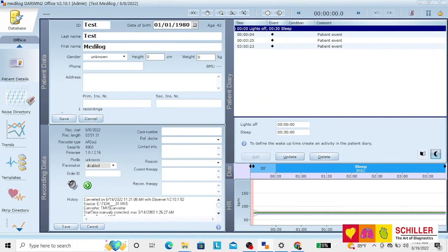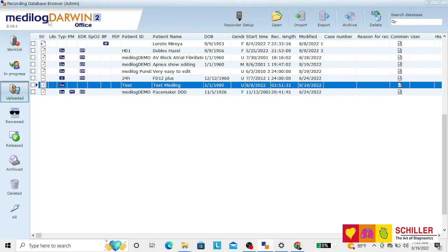At that moment, your recording is ready for analysis.